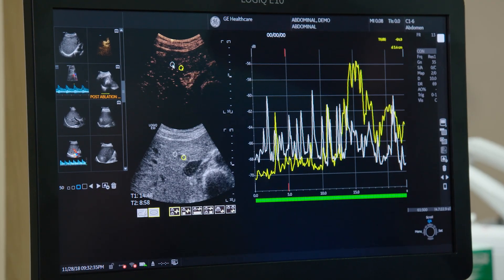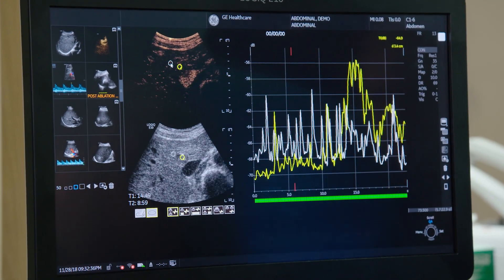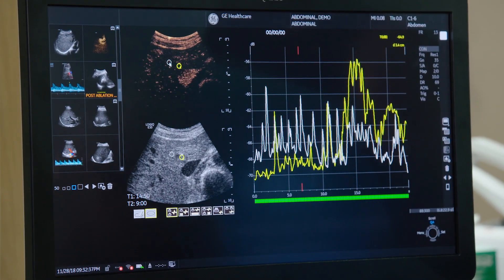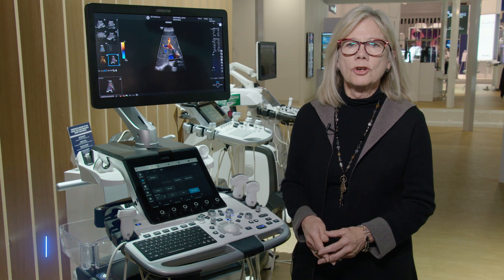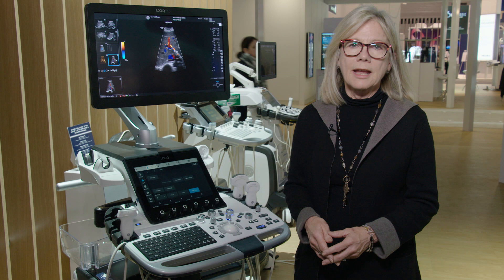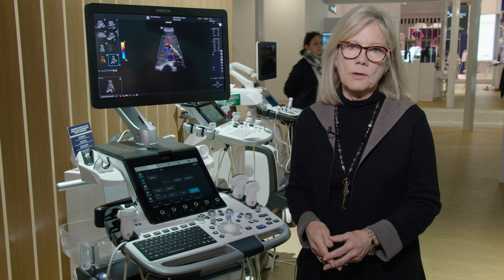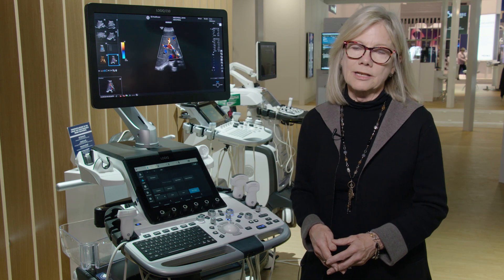That's why we've introduced our next generation product, the Logic E10. And as Brian mentioned, a huge focus of our product development for the Logic E10 has been on liver disease. I'd like to show you a few of the expert tools that we have on the Logic E10.